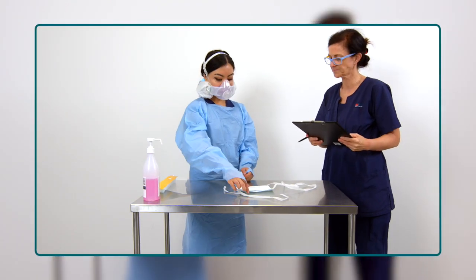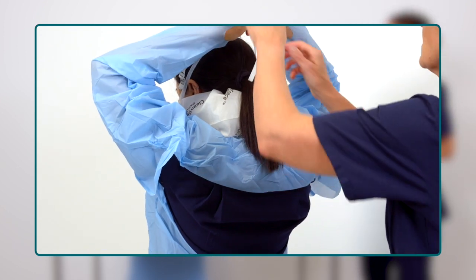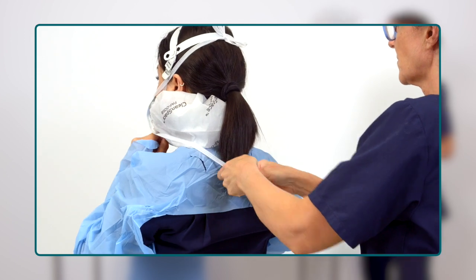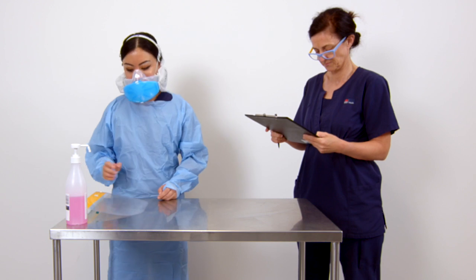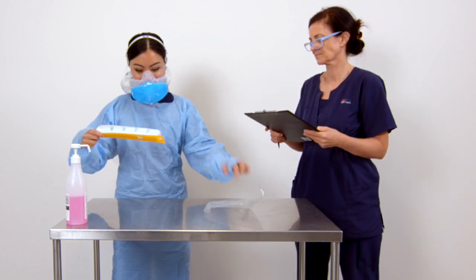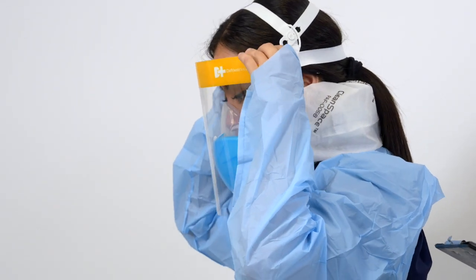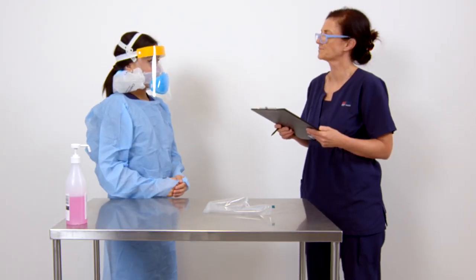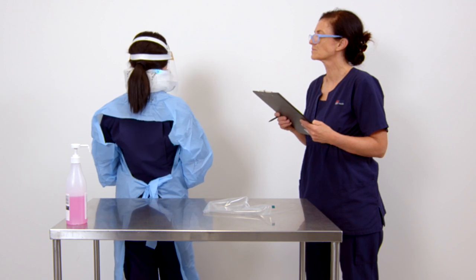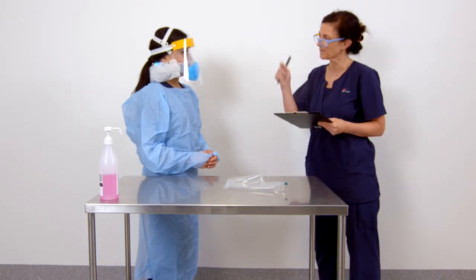If a Steri Plus is not being used, place the surgical mask over the exhalation valve now. Put on your eye protection, either a face shield or safety glasses. Inspect your PPE with the buddy. The buddy should check that the power unit is responding to your breathing and that no alarms are sounding. Now you are ready to enter the patient zone.